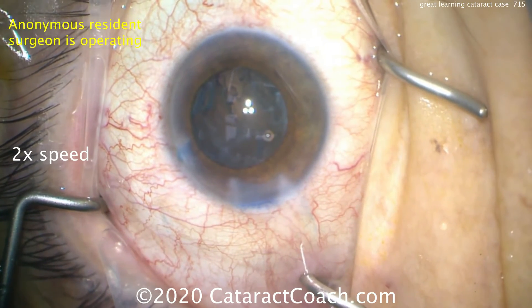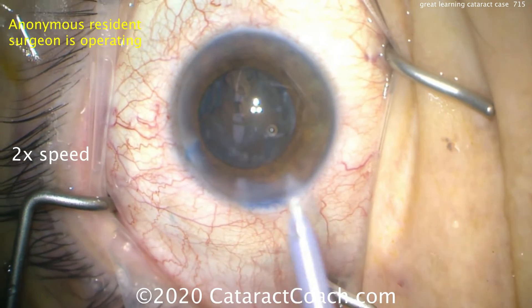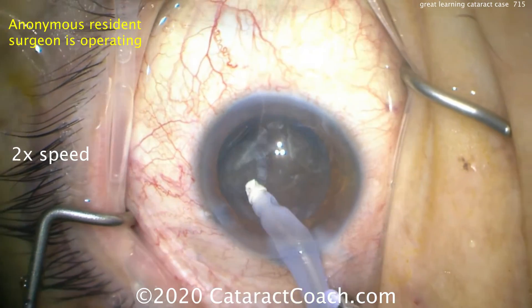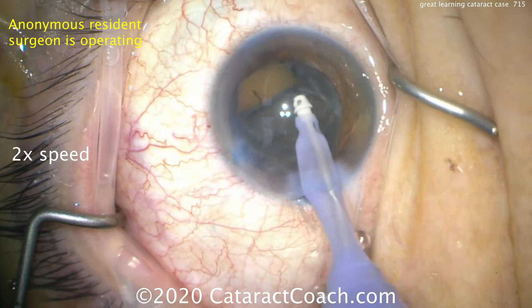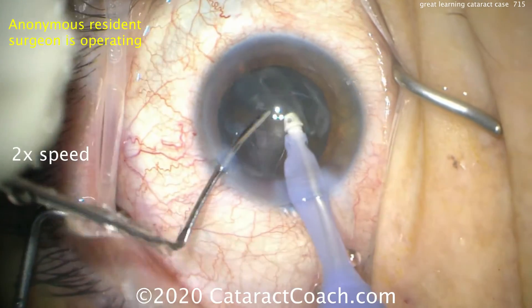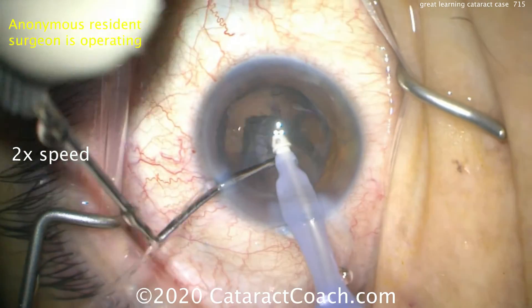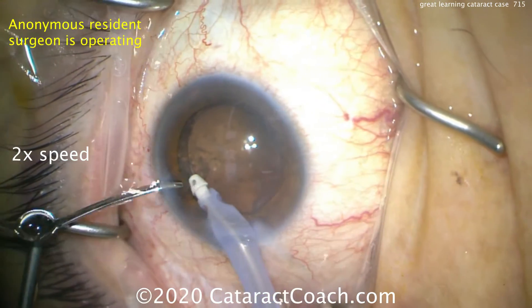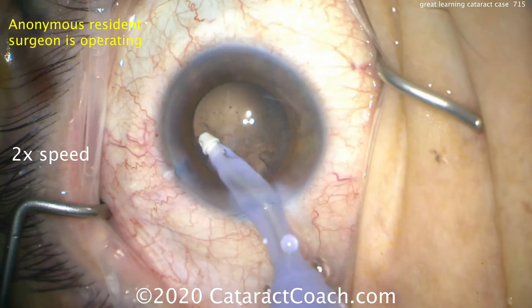The resident is going to switch over to the IA probe, which offers a lot more control to remove the cortex as well as this leftover epinucleus. Port up going in here — a nice aspiration. If this is too thick of an epinuclear shell, you can use your second instrument and mush the pieces into the smaller IA port, and those go down pretty nicely. Notice how the IA stays in primary here — this is a pretty good job for only having done about 40 to 50 cases so far.